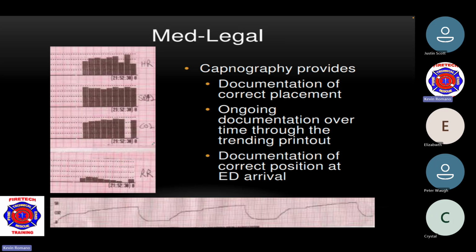When I first started EMS, I saw doctors take out intubation tubes so they could do it themselves, so they didn't believe you were actually in. Then they would probably miss themselves too, and then they had a poor outcome, right? So again, this shows it's in. The monitor is not going to lie. Carbon dioxide is going to come out and give a reading, and you confirm that you're in the airway.